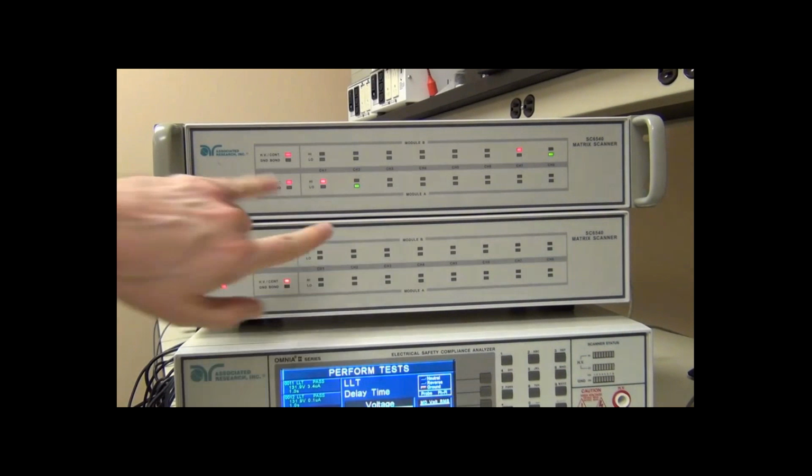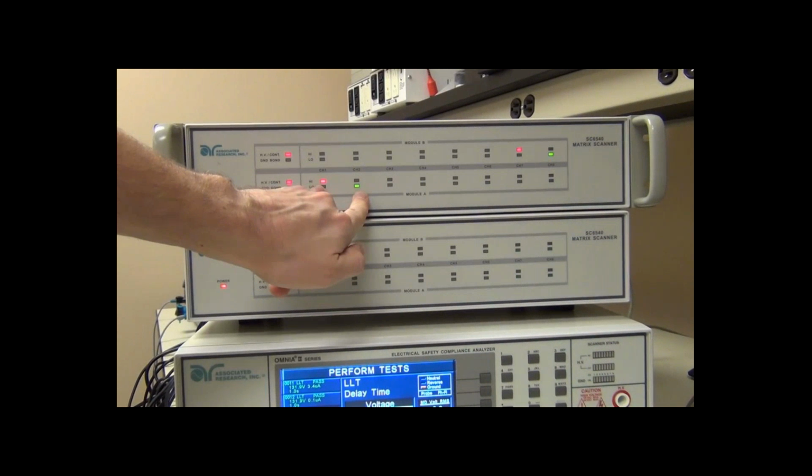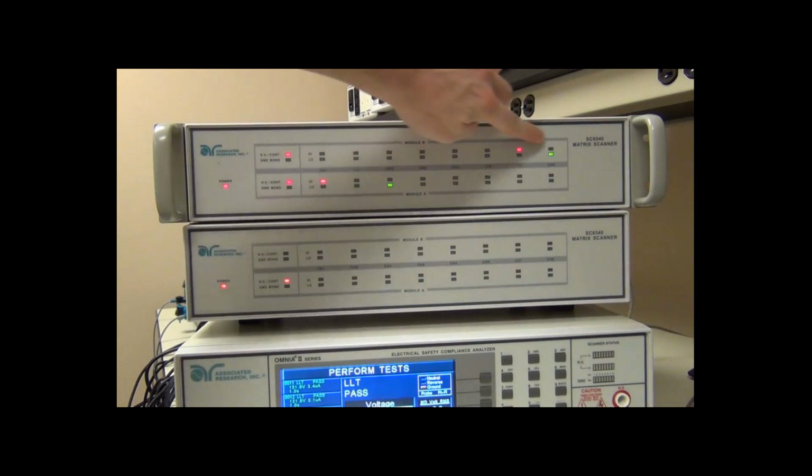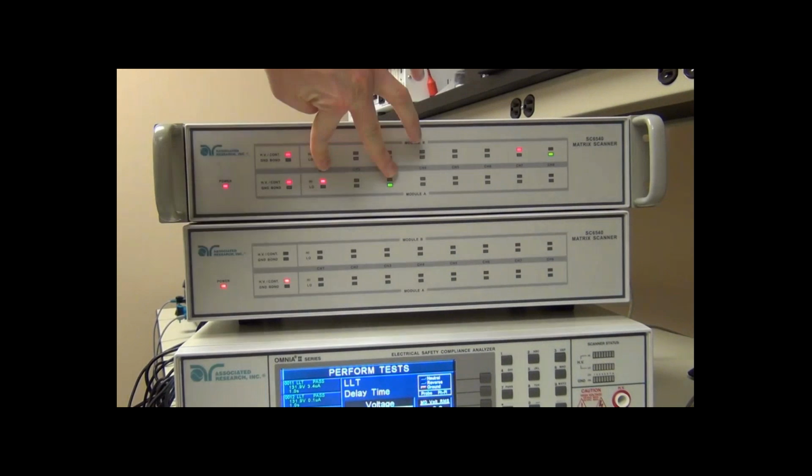So now we can see patient lead 1 to patient lead 2, probe high to probe low. So we have our probe high, probe low here. Now we have patient lead 1 to patient lead 3. And finally, patient lead 1 to patient lead 4. Finally, we have our mains on applied part tests.